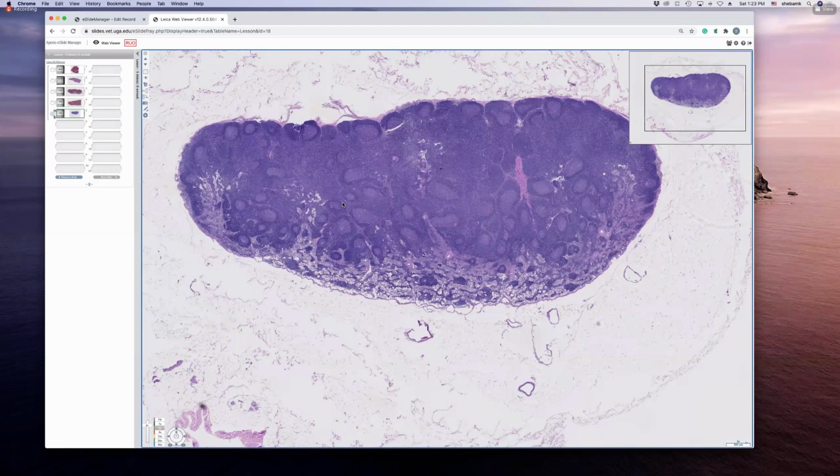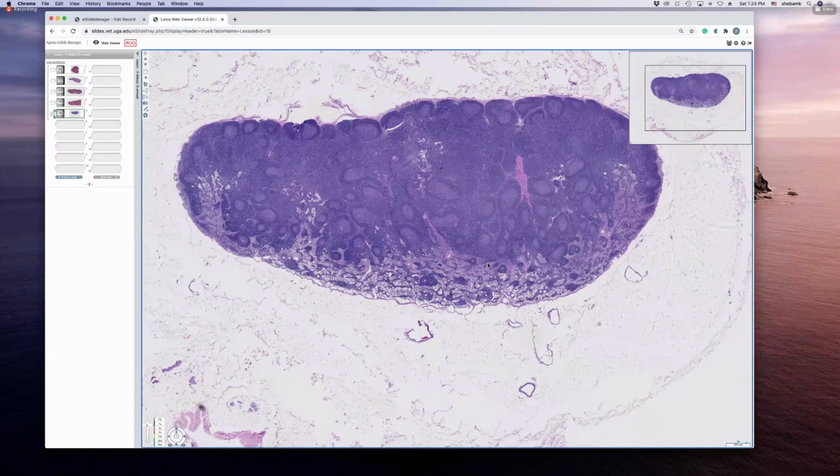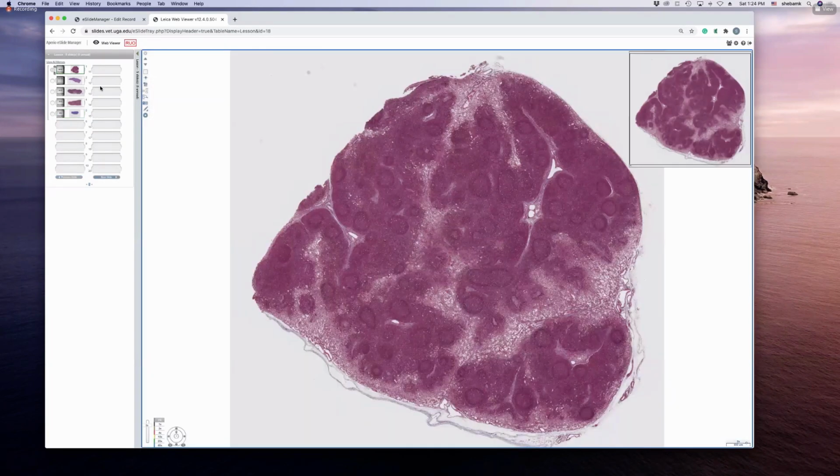So Dr. Eva, I actually had a question for the lymph node. Can you see the antigen presenting cells? You have to stain them with specialized stains, with antibodies to actually differentiate the antigen presenting cells. You won't be able to see them in an H&E stain distinctly. Got it. Thank you. We can say, okay, there are antigen presenting cells here, but we won't exactly know who it is unless we use specific antibodies.